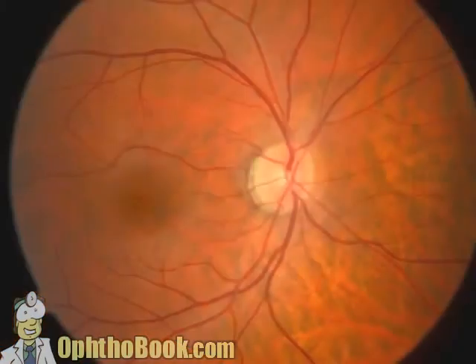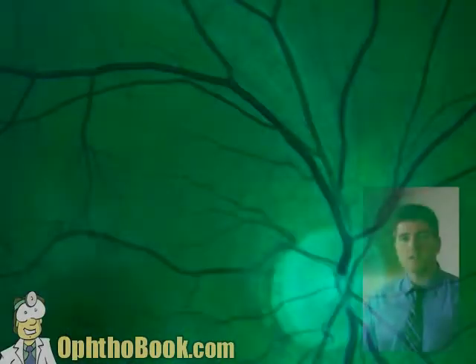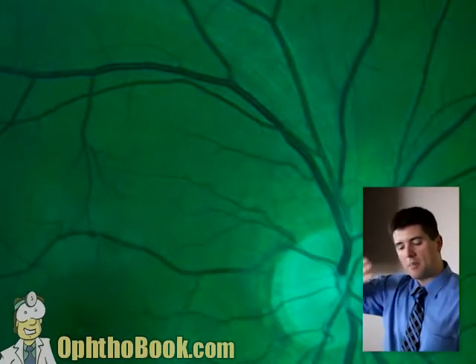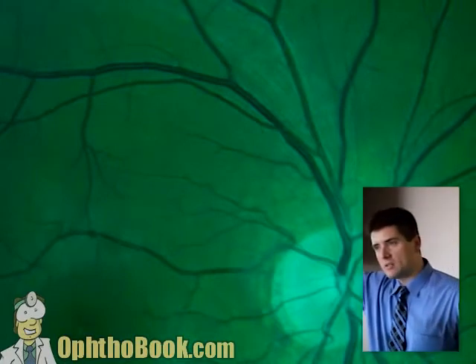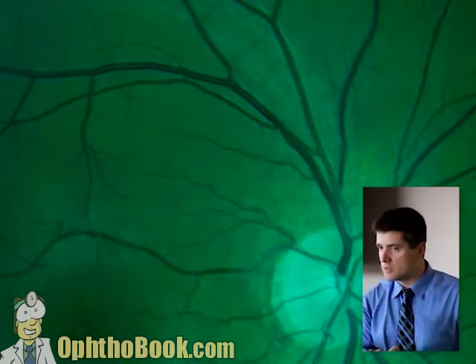This is very interesting because if you can throw out all the red information, you can see a lot more structures in the eye. Looking at the retina, which is mostly red, if you throw out that redness, you can see the blood vessels much easier, they become darker, and you can actually see some other findings. If you look carefully, you can see sort of a white striation pattern coming off the top of that nerve and fanning out like a fan. That's actually the nerve fiber layer running along the surface of the retina.